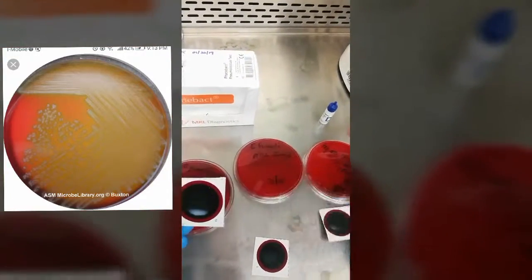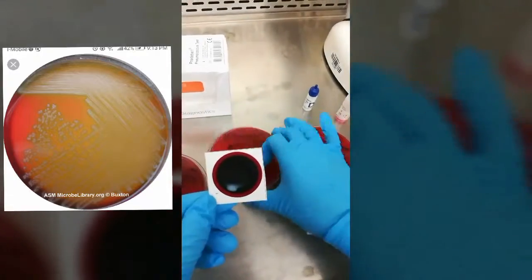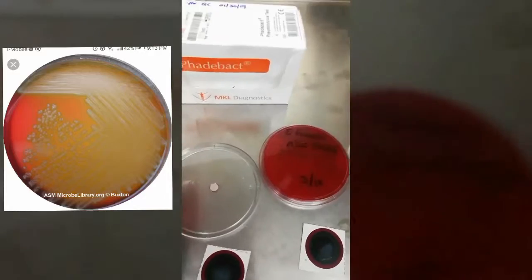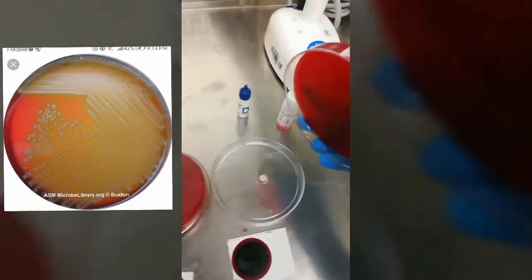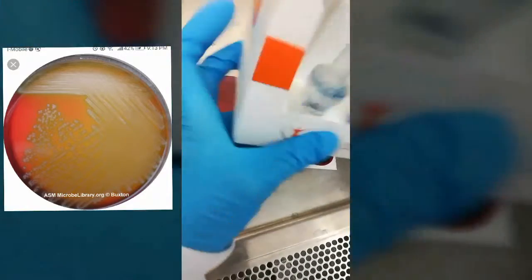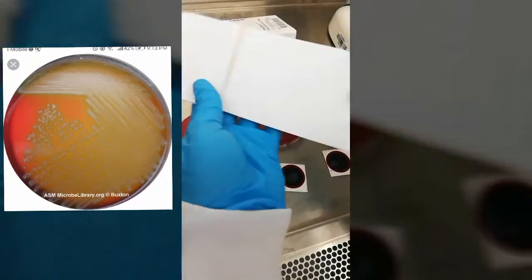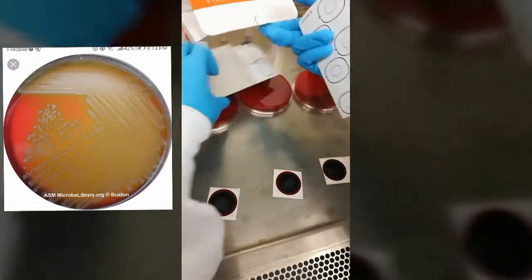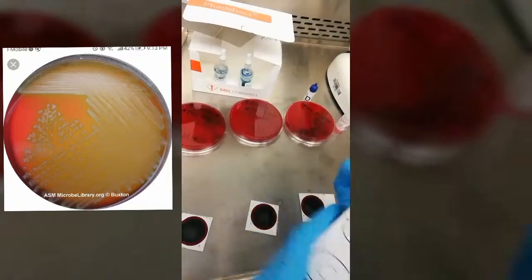For the Streptococcus viridans group, PYR test is negative. Streptococcus group D test is negative. Pneumoslide test is negative. And catalase test always needs to be negative.